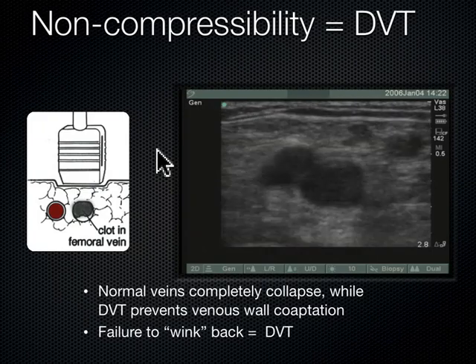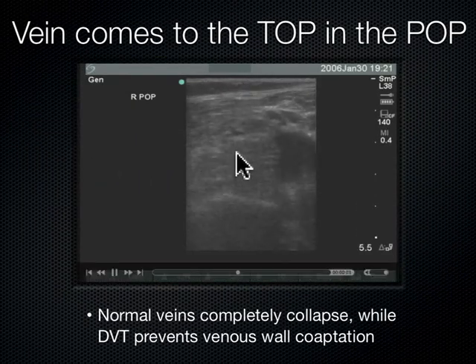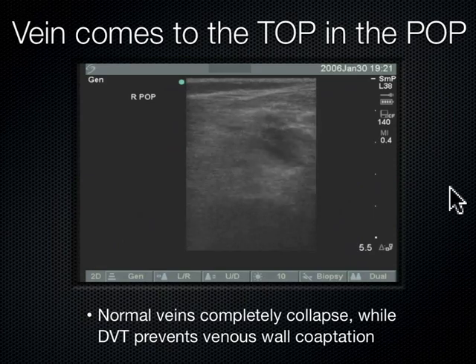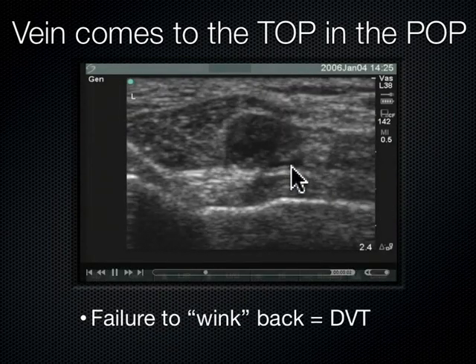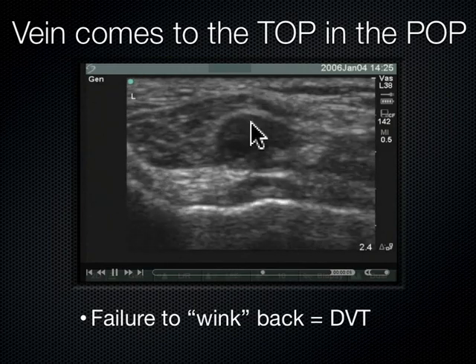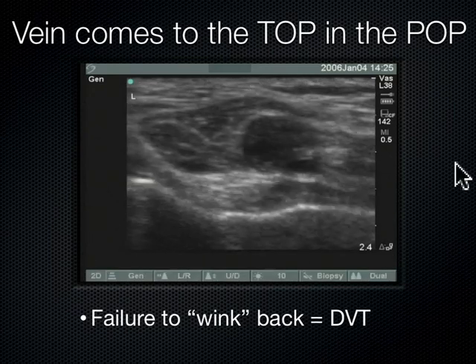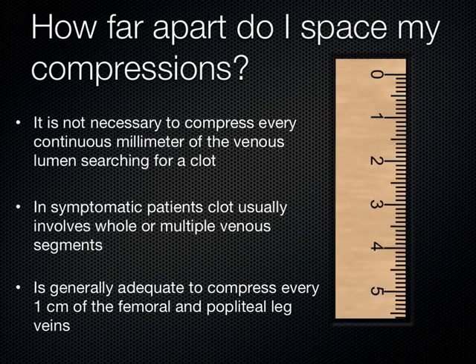Here we are in the pop — remember the vein comes to the top in the pop. Here's the popliteal vein up here, popliteal artery, and the vein is easily compressible with no clot. This is what it looks like when there is a clot — popliteal artery, we're pushing so hard the artery is actually winking at us. This is the popliteal vein, very dilated with echogenic thrombus in it. How far apart do you space compressions? Clots usually involve multiple whole venous segments, so it's adequate to go every one centimeter between compressions.